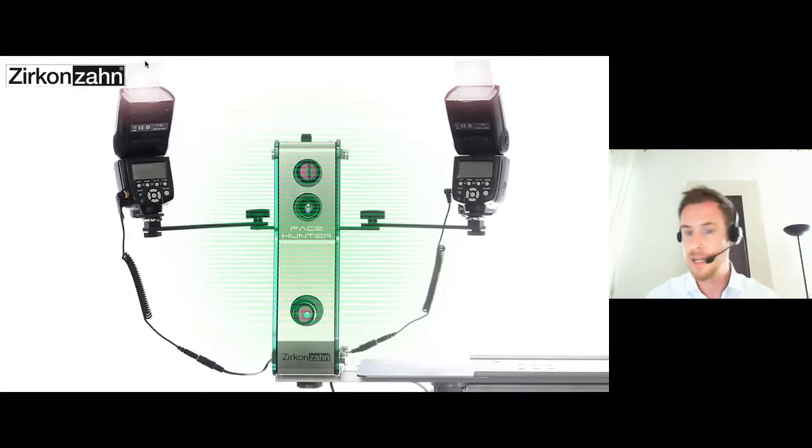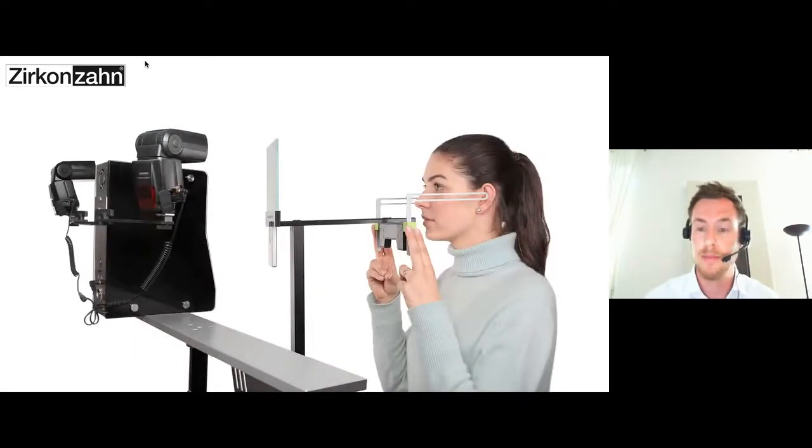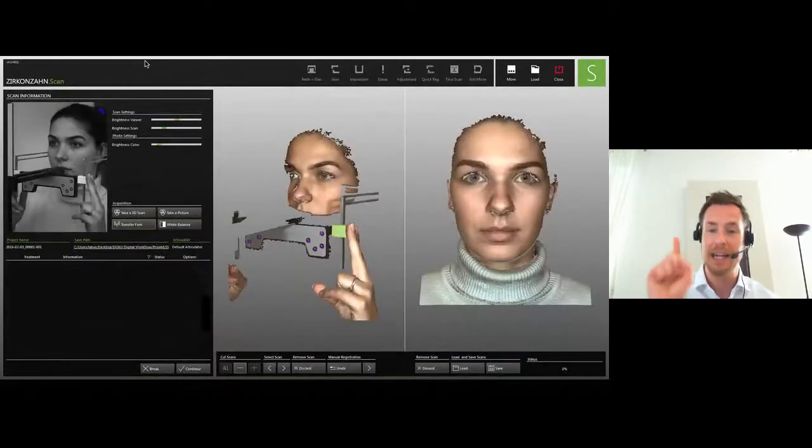The Face Hunter does not make just 3D facial scans. We are able to capture the unique head position by taking shots, photos. So we position the patient again in the plane finder. We mark the patient's head, we control the position and place the Face Hunter in front of the patient, Face Hunter and plane finder. As you can see on the plane finder, there are little dots, and those dots are scan markers we are able to use to transfer the head position into our software by clicking the mouse and doing just one shot. That's amazing. Now I have my natural head position in our scan software.